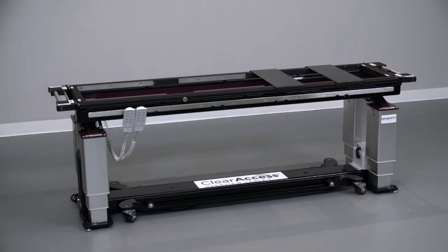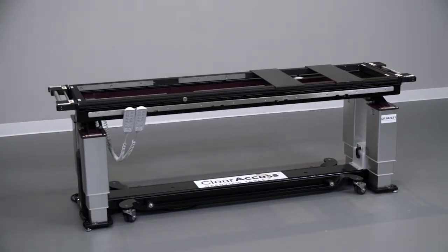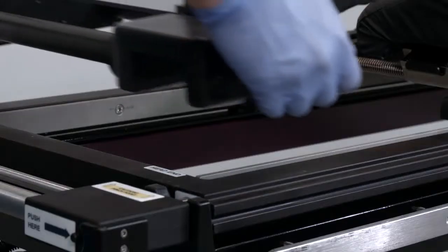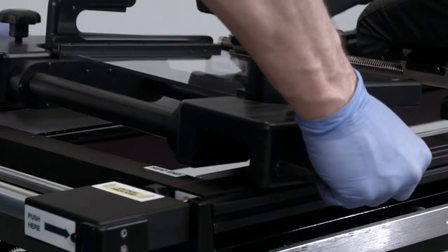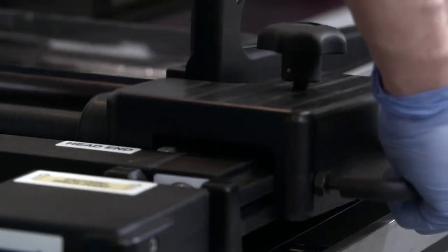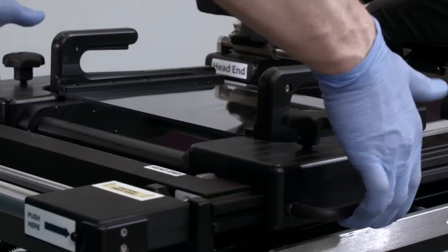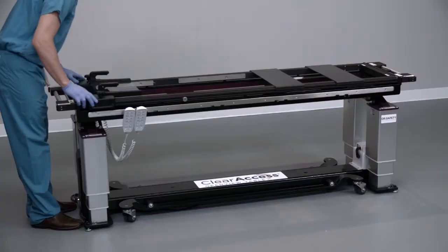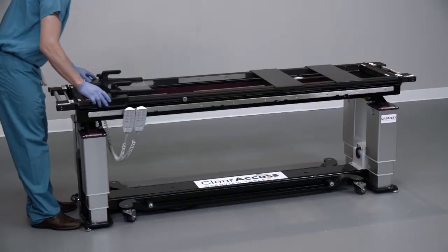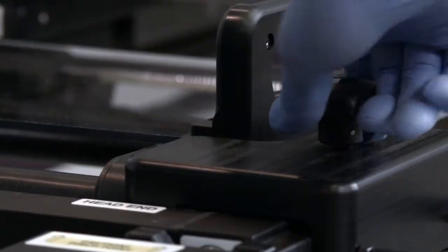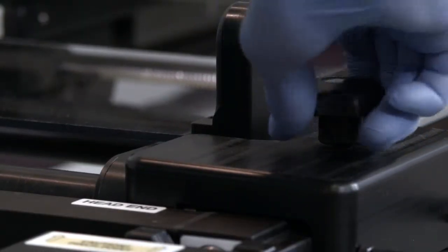Install the ClearAccess head support by grasping the installation handles on either side of the device. Hover the head support over the head end of the table and pull outward on the installation handles. Place the head system onto the prone platform and release the handles. Verify that the head support is engaged by lifting up on the handles without pulling outward. Slide the head support to the desired location and lock in place by tightening both locking knobs.